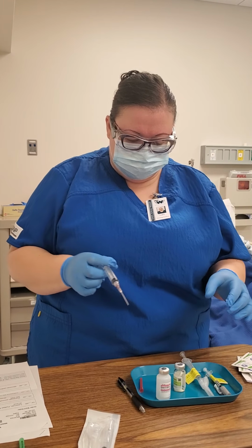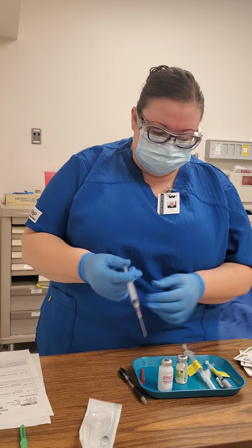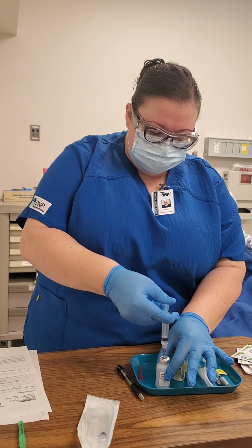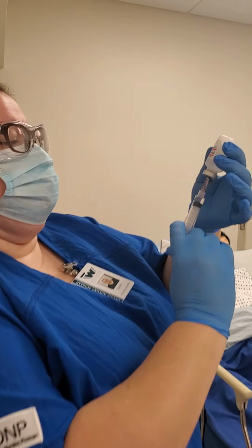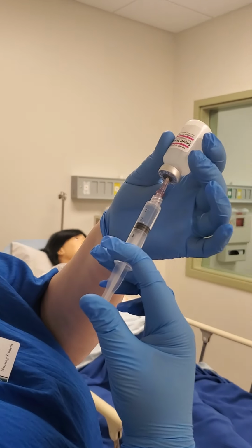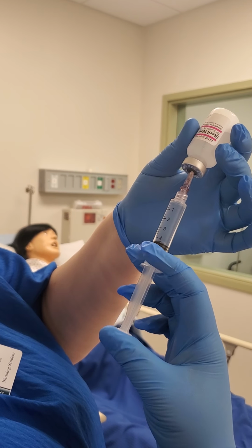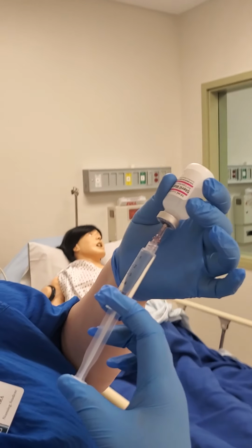Okay. And then I'm going to withdraw 5 milliliters of solution here. I'll pull my needle out now. I'm actually going to do a little bit more just to make sure that I have enough.